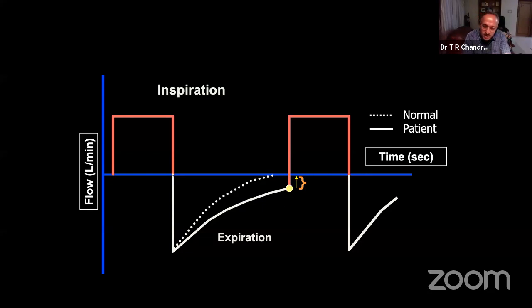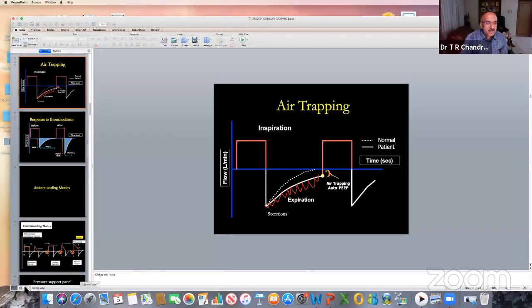You got my point. If the patient is paralyzed, you can change the IE ratio. If the patient is on pressure support, how do you shorten the inspiratory time? By shifting the expiratory trigger sensitivity from 25% to, I'll go to that slide, we'll see, wait.